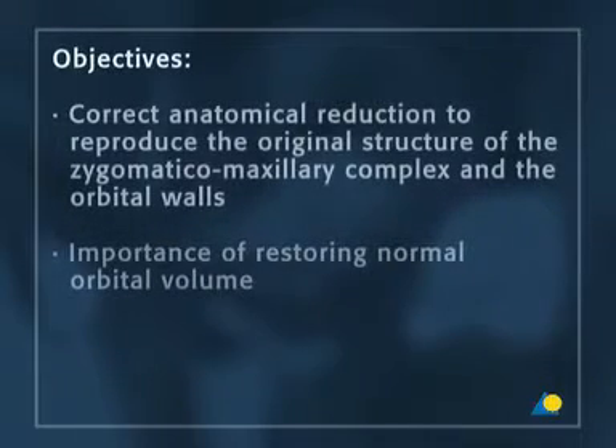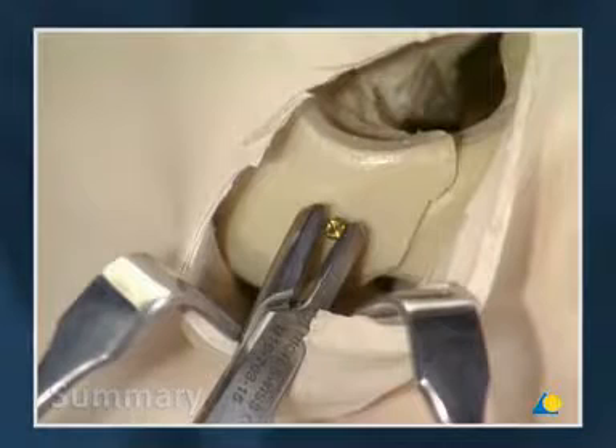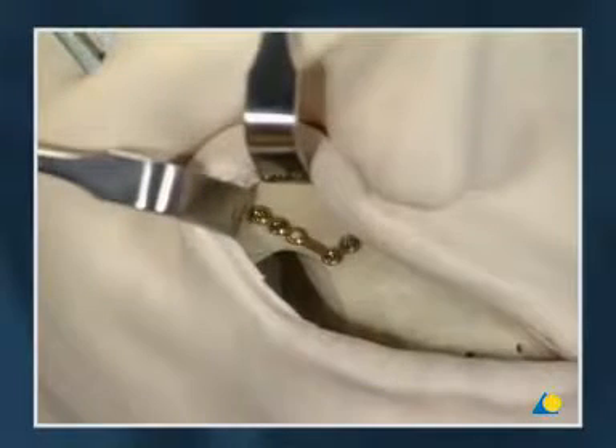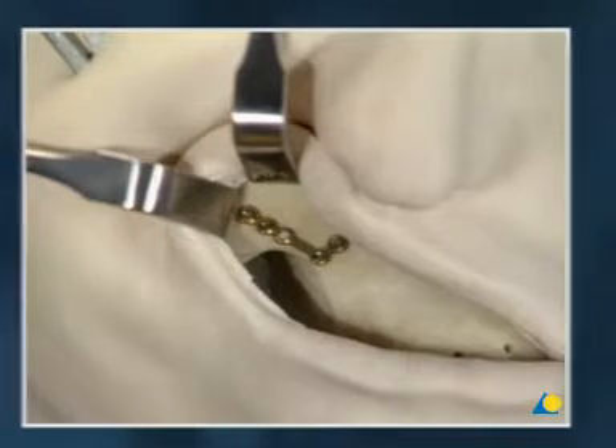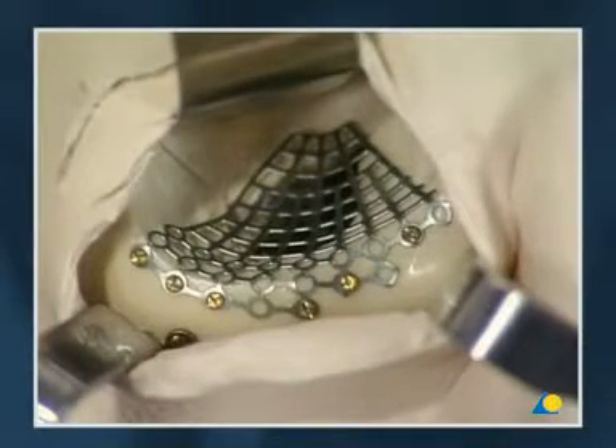This exercise has shown the correct anatomical reduction to achieve the original structure of the zygomatic maxillary complex and orbital walls, as well as the importance of restoring normal orbital volume. Here are the main steps once again: reduction of the zygoma with the help of the manipulation screw; fixation of the frontozygomatic suture with a 1.3 adaption plate; fixation of the zygomatic maxillary buttress with a 1.5 L plate; trimming and contouring of the 1.3 orbital floor plate; and fixation of the plate with 1.3 mm screws.